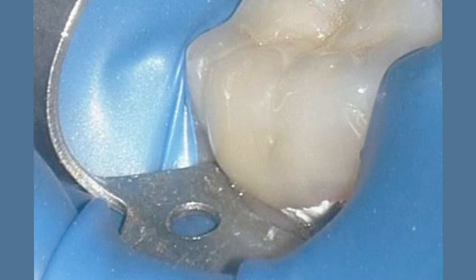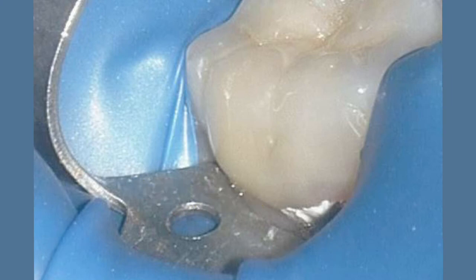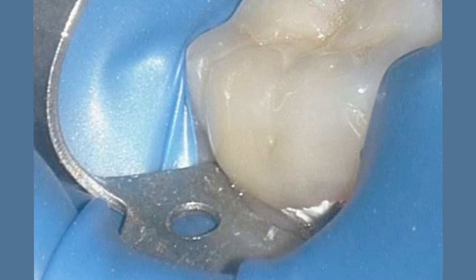This image shows the tooth a few days following repair when the patient was seen by me for root canal therapy. Invasive cervical root resorption is rare in molars. The pathological entities are usually limited to the anterior teeth, where the disease process is induced by trauma, a history of orthodontic therapy, internal bleaching using hydrogen peroxide based solutions, or idiopathically.